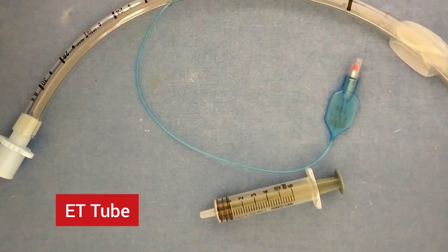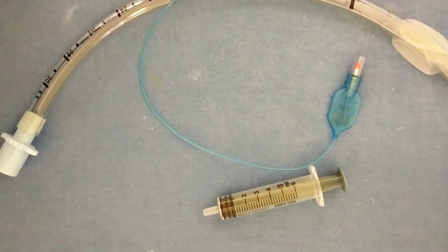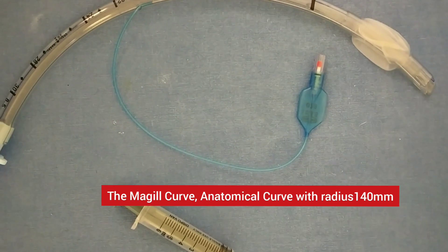A tracheal tube is a catheter that is inserted into the trachea for the primary purpose of establishing and maintaining a patient airway to ensure the adequate exchange of oxygen and carbon dioxide.